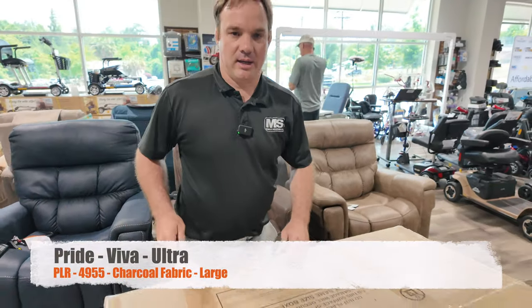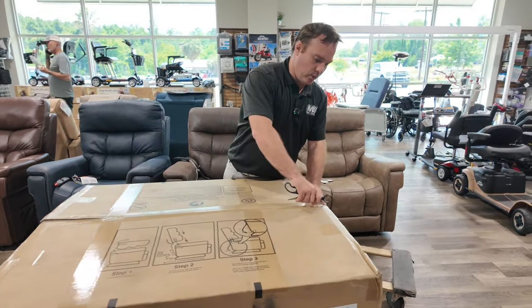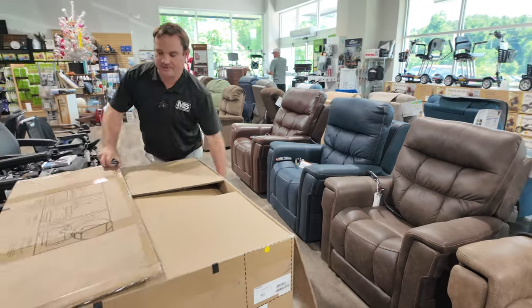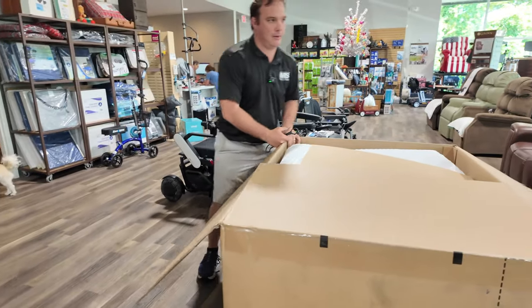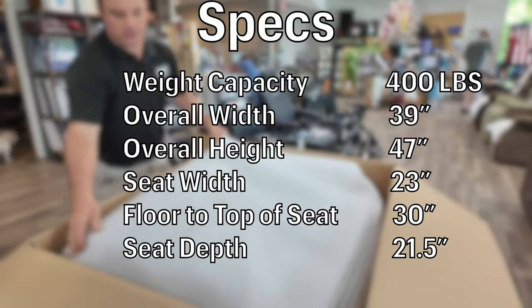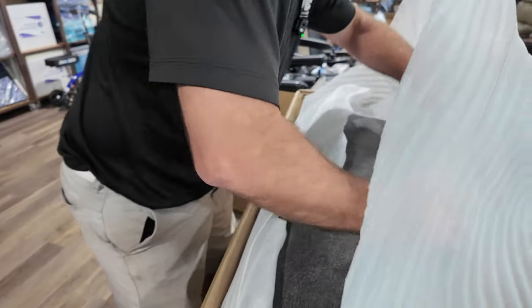Hey, I'm Chris with liftchairusa.com. The PLR4955 is coming in some new colors — we're going to show you this one in charcoal. It's a fabric and it's my first time seeing it, but it's here. Now you have seven options of color and fabric to choose from.